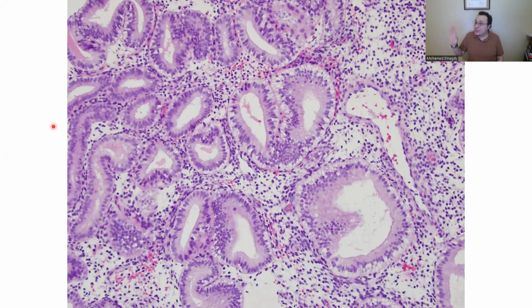Okay, everyone loves science, and I know that the attendings love this sophisticated description. Please be descriptive. But what I need to make sure from these sessions, I will hit well in the boards. Once you subspecialize, you'll be able to have this sophisticated description. But I will tell you, the sophisticated description is that you actually have dilated glands here. You missed that, Aliyat. You said there is no dilation.